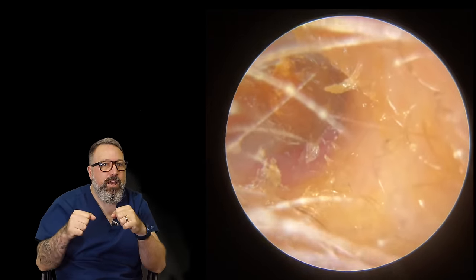The oil stops it from adhering to the canal wall all the way down - this should help it to slide out a little bit easier. It also helps you get a good grip with the suction tube. So we're just giving this a little bit of a wiggle, lifting from the canal wall. There we go, it's on its way - out, this is starting to come. So the plug's on its way out. I don't think there's going to be much beyond that because we could see the very top, the pars flaccida, the very top portion of the eardrum or tympanic membrane. But we're just clearing up some of these looser bits.